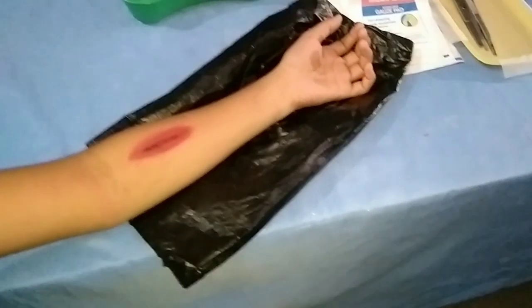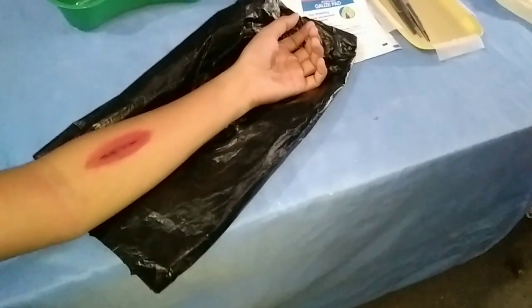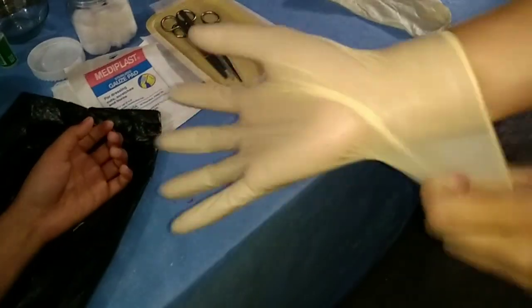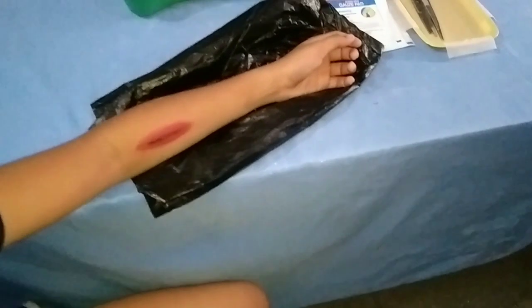Okay, next is to obtain the aerobic culture. So we need to put on another pair of gloves again. Then open a specimen tube and place the cap upside down on a firm dry surface.